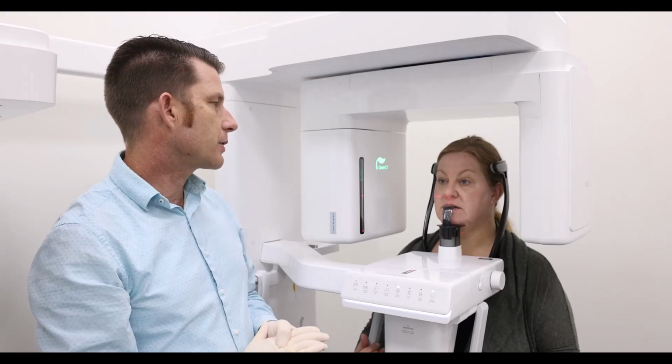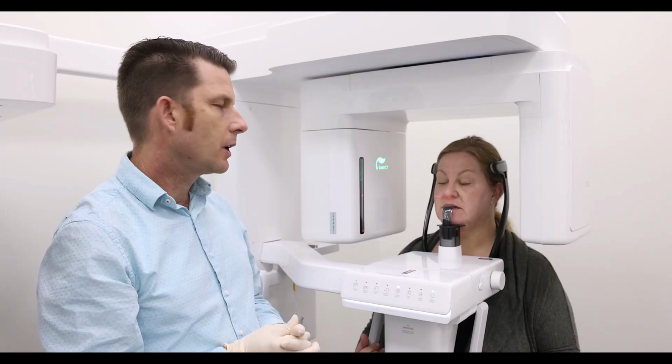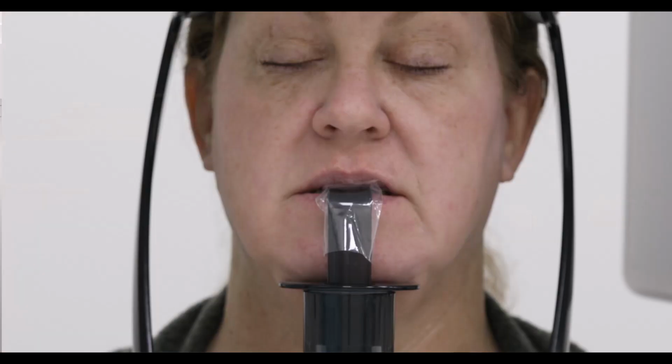I'm going to have the patient just go ahead and close your eyes, relax, and with CBCT capture, the patient can just relax their tongue. So I'm going to click on the Ready Return button. The system is moving into image capturing position.